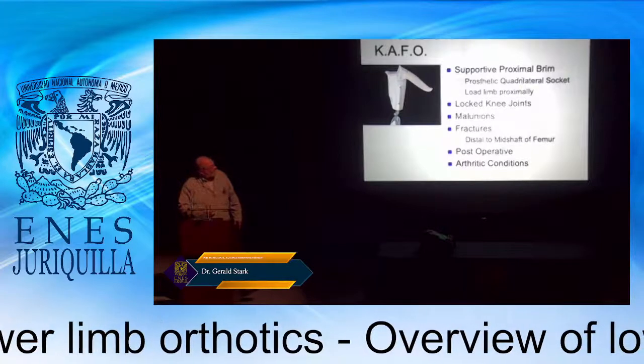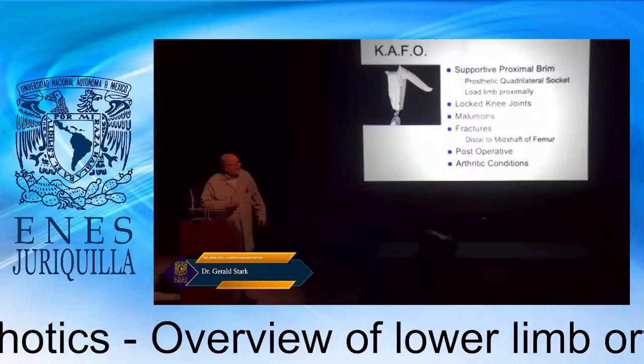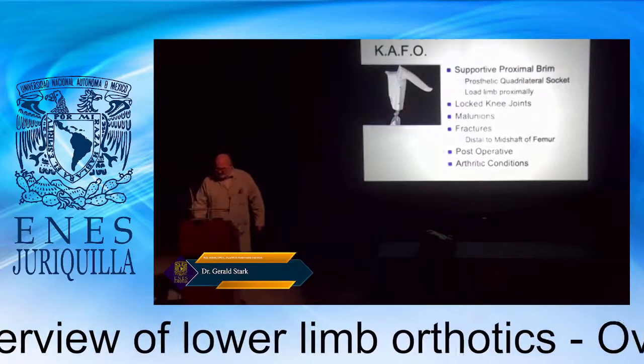And this is for malunions of fractures when you want to unweight the limb, and you have to use a locked knee joint for this, or for arthritic conditions.